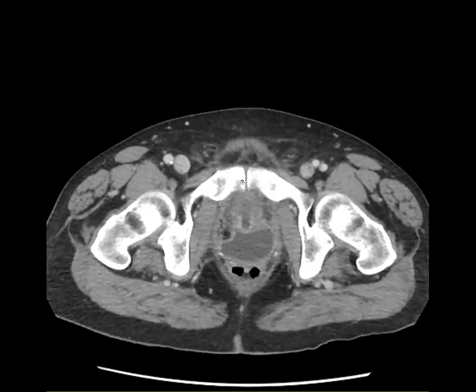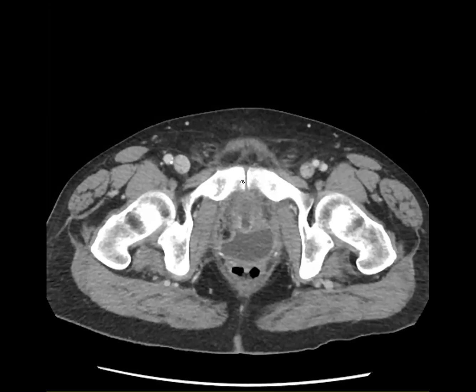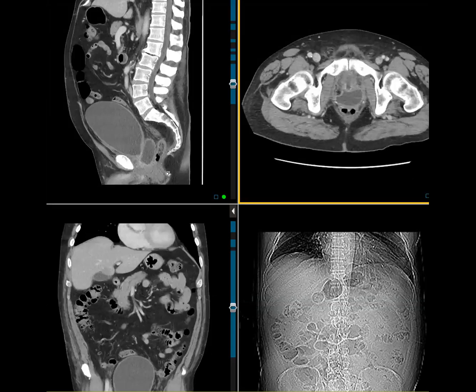It reminds me of a case that Steve had. Gitanjali is saying urethrovaginal fistula, but Gitanjali, I think this patient had a prostatectomy. Yeah, that's the key. So I think Rupa is saying defect in the urethra. Yeah, exactly. I think it's a dehiscence of the anastomosis between the bladder and the membranous urethra.